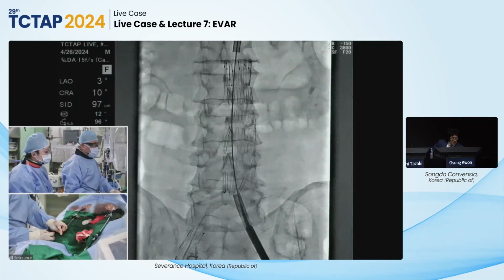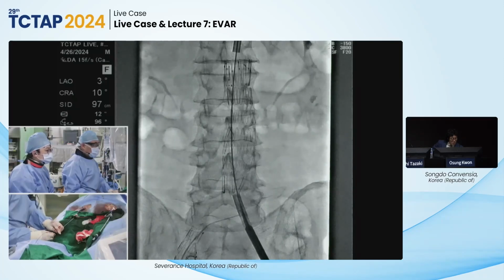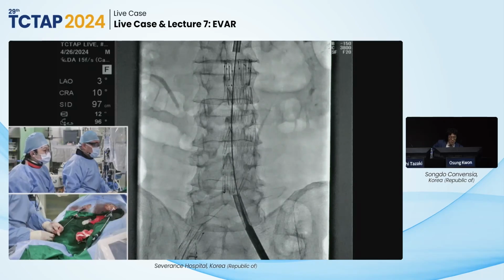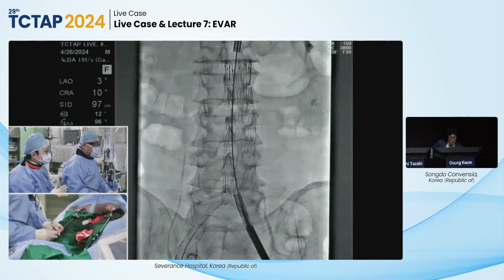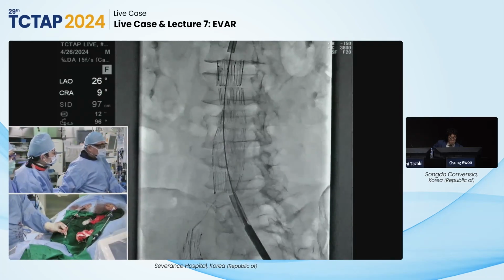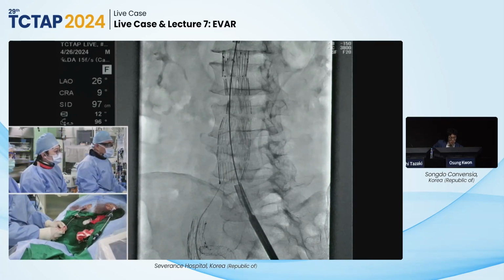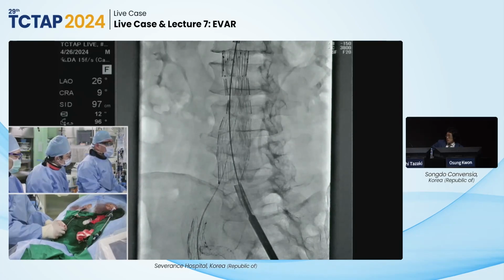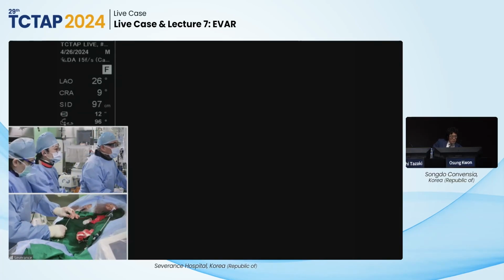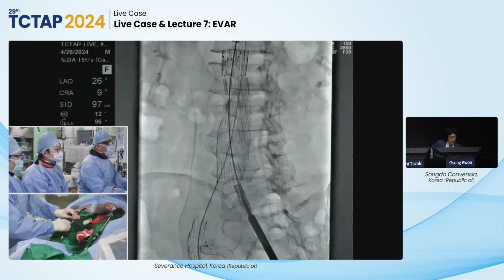Actually, I don't recognize the regimen, but we call it MAC anesthesia, which is monitored anesthesia, the combination of painkiller and sedation. He is conscious, but usually feels free from pain. So we utilize this method in every kind of endovascular procedure, including TAVR. Nice job. So you are supported by the anesthesia? Oh yes, a specialized anesthesiologist dedicated to our hybrid operating room always covers our endovascular cases.